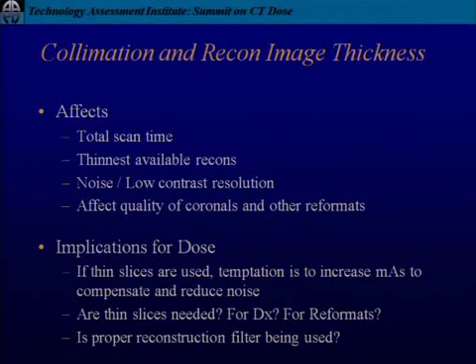A good little experiment is to use your widest beam, look at the images formed from the detectors on the periphery, and compare them to the images formed from the detectors in the middle, and they're not the same. Especially if you're doing an ACR accreditation, I did this once, and I thought, those look terrible. And then I realized: dumb physicist, use the middle.